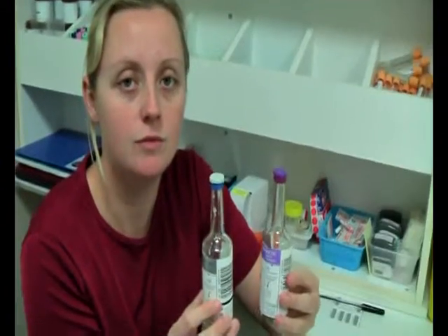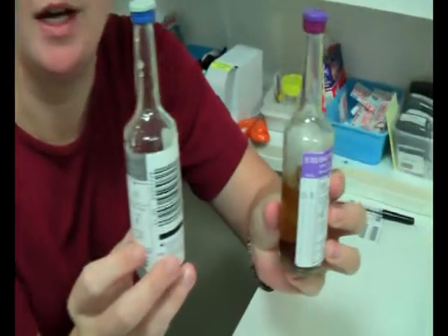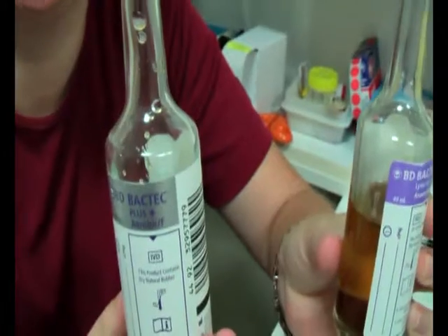We use 2 bottles. One anaerobic with no air present in the bottle, and the other one aerobic, which has air in the bottle.